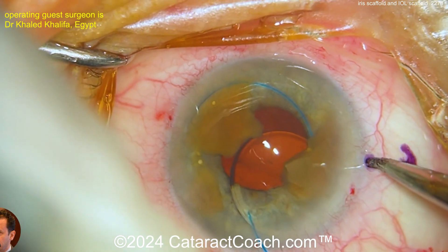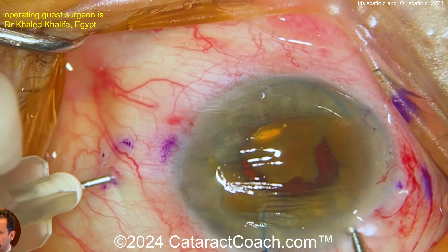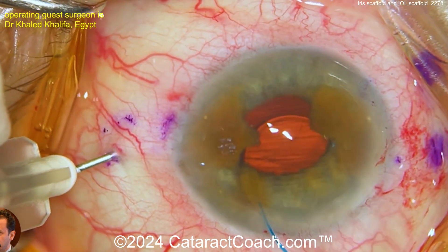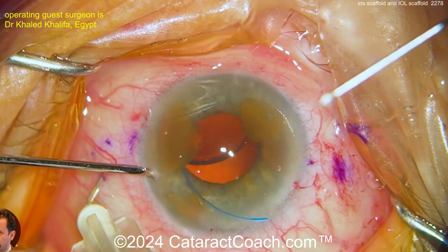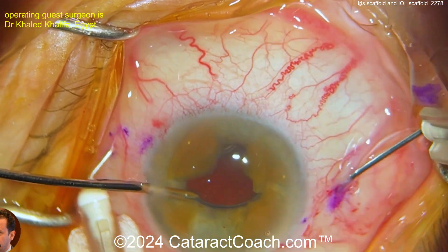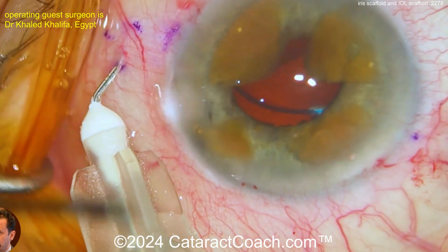More viscoelastic. Now — there's still some nuclear pieces in the eye. Perhaps because the IOL is just not staying centered and not acting enough of a scaffold or barrier, you can externalize the haptics now. There's one side, here's the other one with a 30-gauge thin-walled needle — get that going. Here's the needle, trailing haptic going in there too. Where's the optic, by the way?